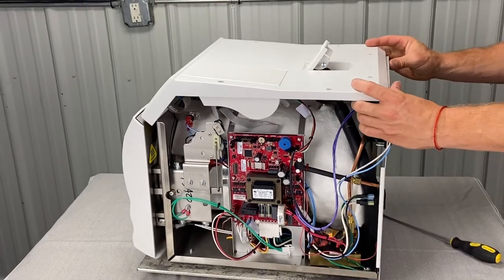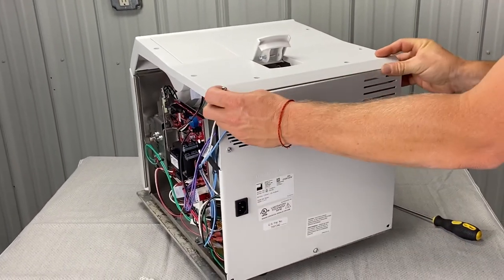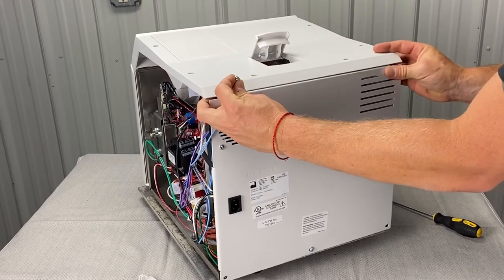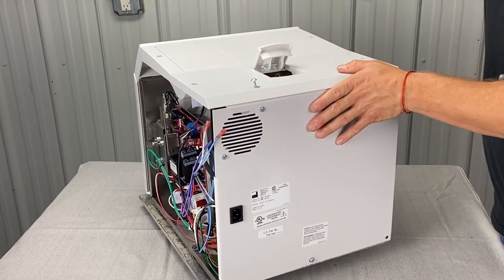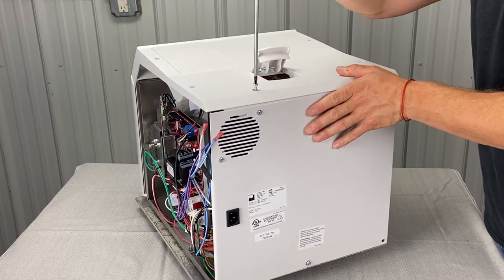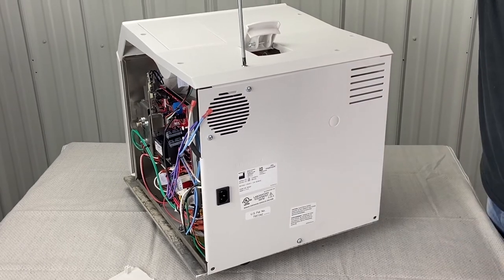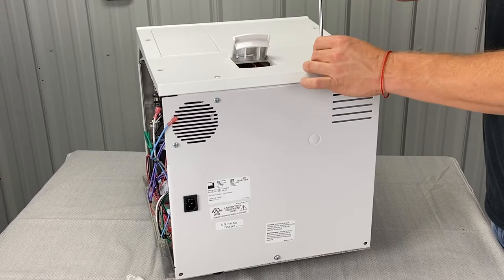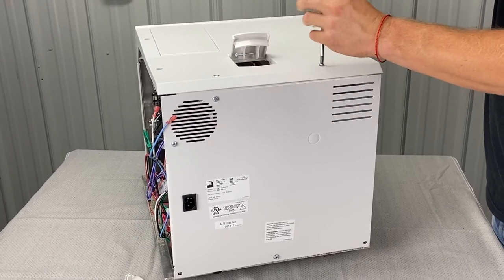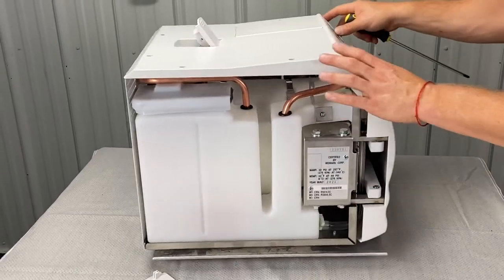Now we're going to screw these two together first — that way it holds together and we can easily do the side panel. We got one screw in here, you're going to have to line up the holes, Phillips screw. You don't have to necessarily put that in all the way, but just don't forget to screw it in. Then we can go back and put this screw in. Now we got the front and the top on.